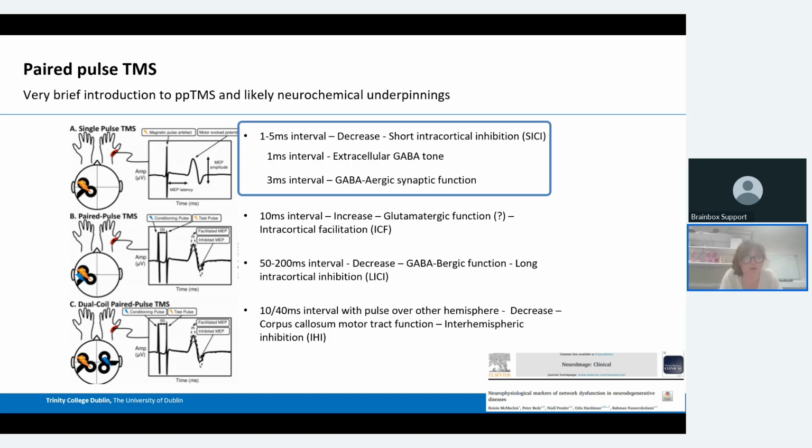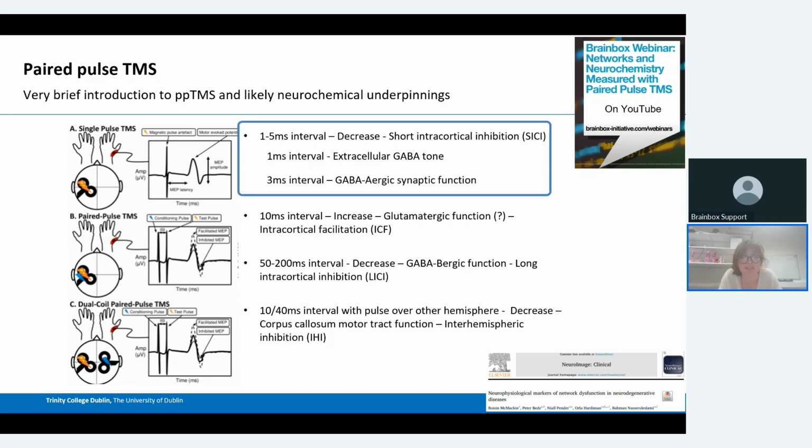If you want to know more about that, Charlie Stagg and I did a webinar about that a few years ago, and all its wonderful complexities. That is on YouTube if you want to look into it. I'm only explaining SICI here because SICI is one of the measures that's particularly well studied in terms of comparing fixed intensity and threshold tracking TMS.